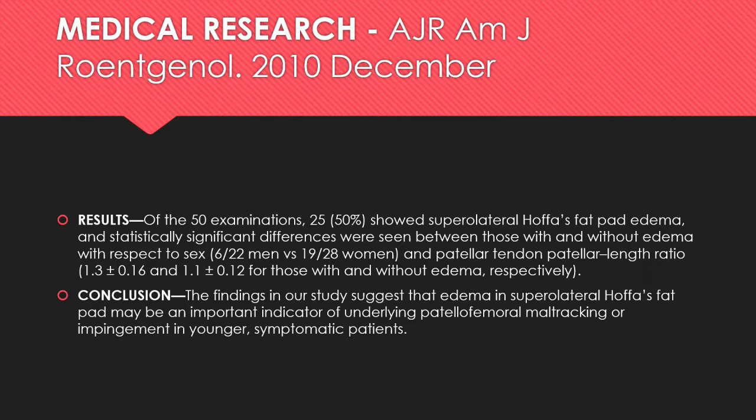The findings of the study were as follows. Of the 50 MRI films studied, 50% showed Hoffa's fat pad edema.